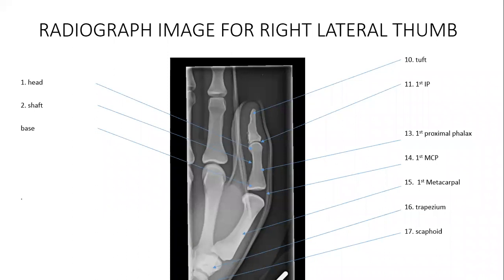The location of the central ray was aimed at the joint of the first metacarpal. There was no need for any angulation of the central beam. The collimation of the central ray captured the lateral view of the thumb. I collimated the central beam to surround approximately 1 inch outside the skin of the thumb and included the trapezium as well. The KVP range was 50 KVP.